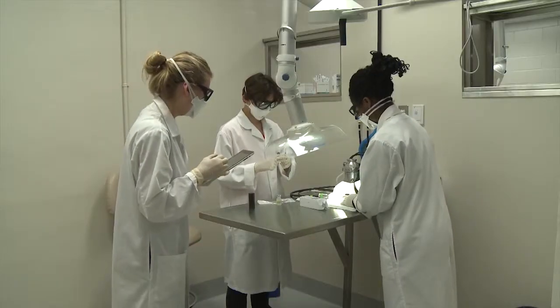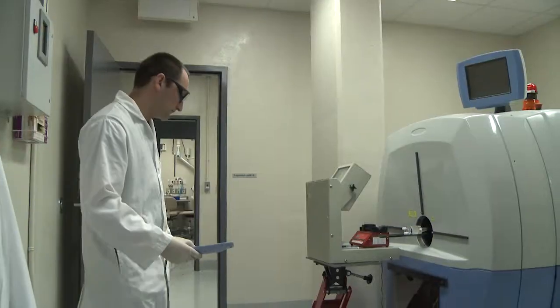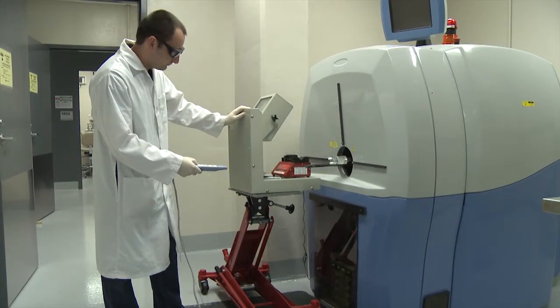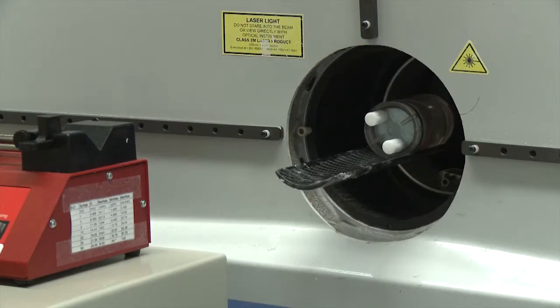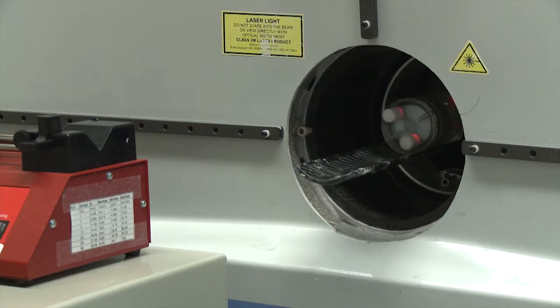As far as PET is concerned, the CIMS has 2 preclinical PET scanners, one of which is PET-CT. Those scanners are based on the detector technology that we have developed here in Sherbrooke. So we operate them at the optimal performance all the time, which means that we achieve a resolution of 1.2 millimeter, which is about the best you can obtain on the market now.